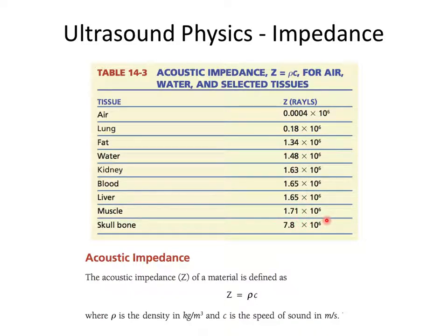And that's why when you're imaging the heart, you must put that transducer between the ribs. You have to shoot the ultrasound between the ribs, right? Because there's muscle between your ribs. Anybody who's eaten pork ribs, right? Yours are basically the same. You got the muscle between there, and you shoot the sound through there. If you move it up and it hits the bone, it's all just going to reflect right back at you.